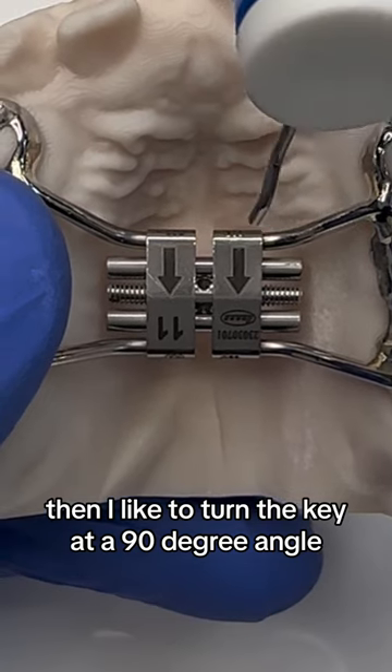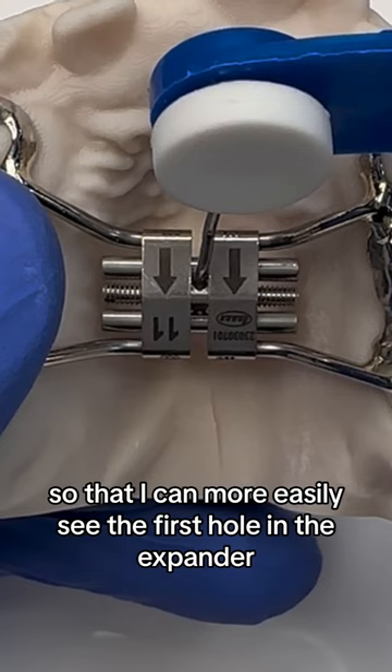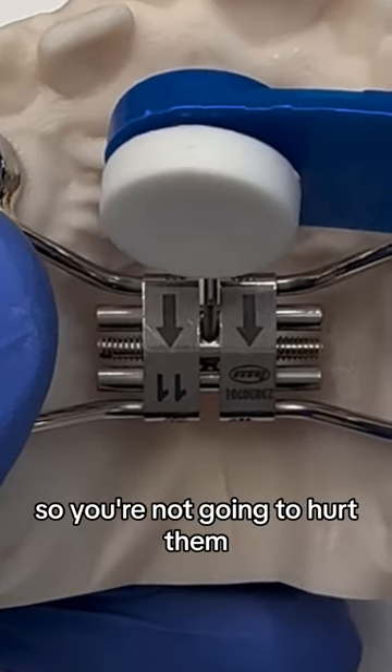I like to turn the key at a 90-degree angle and come in from the side so that I can more easily see the first hole in the expander. Push the key into the expander — it has a little stop on there so you're not going to hurt them.